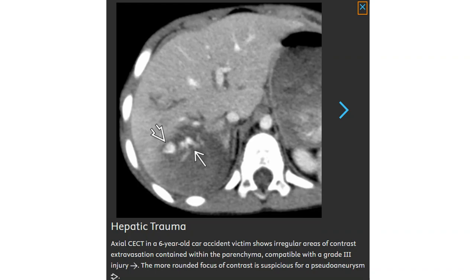Contrast-enhanced CT in another six-year-old victim shows an area of contrast extravasation contained within a deep parenchymal laceration, compatible with a grade 3 injury. The more rounded focus of contrast is suspicious for pseudoaneurysm.